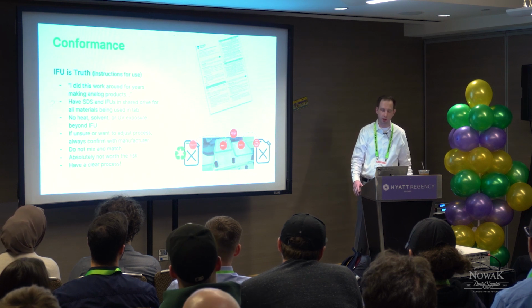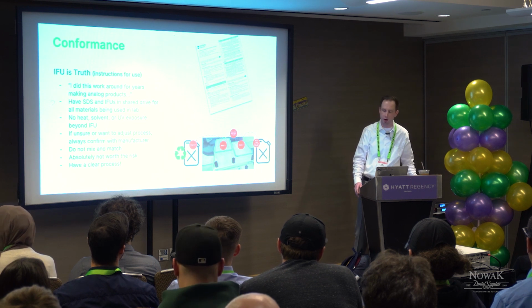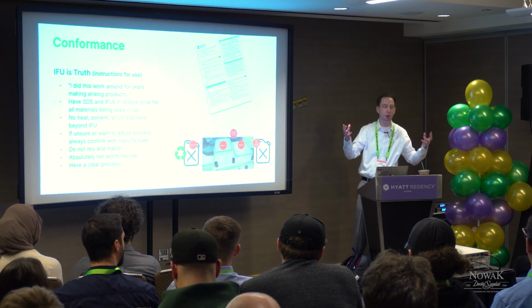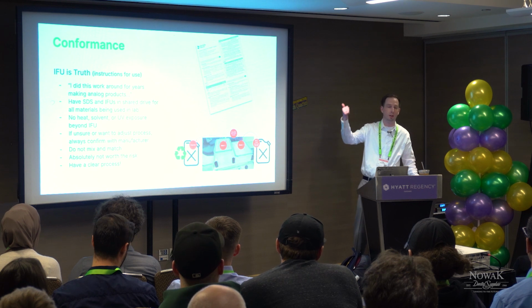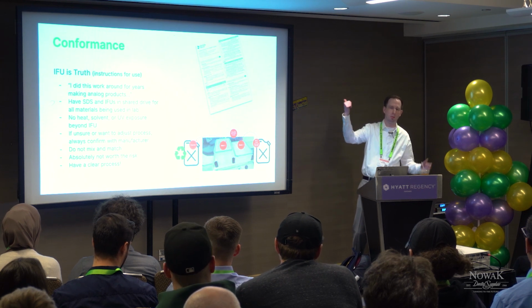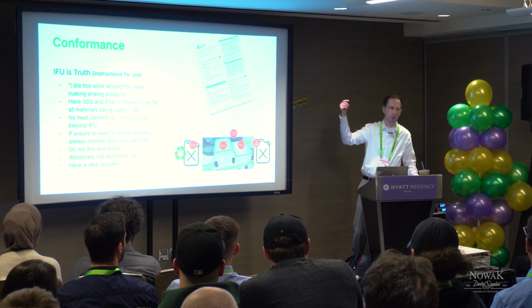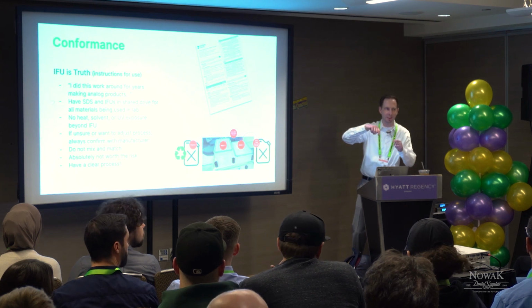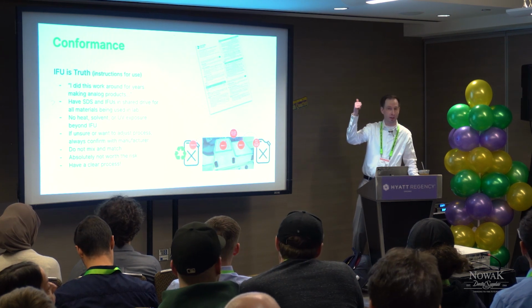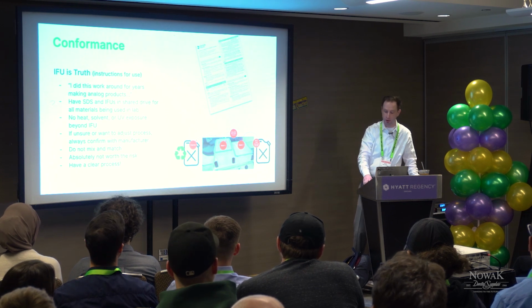I don't care if you might save money on the front end, on the back end it's not good. And I guarantee in the lab industry, if we get more regulation coming into our industry, the first two things they're going to look at are abutments and implants. I mean, they already did this. Was it five years ago now, with the whole thing? Only hand milled abutments. Anybody remember that? They're going to look at implants because it's class 3, and 3D printing, photopolymers, guaranteed.